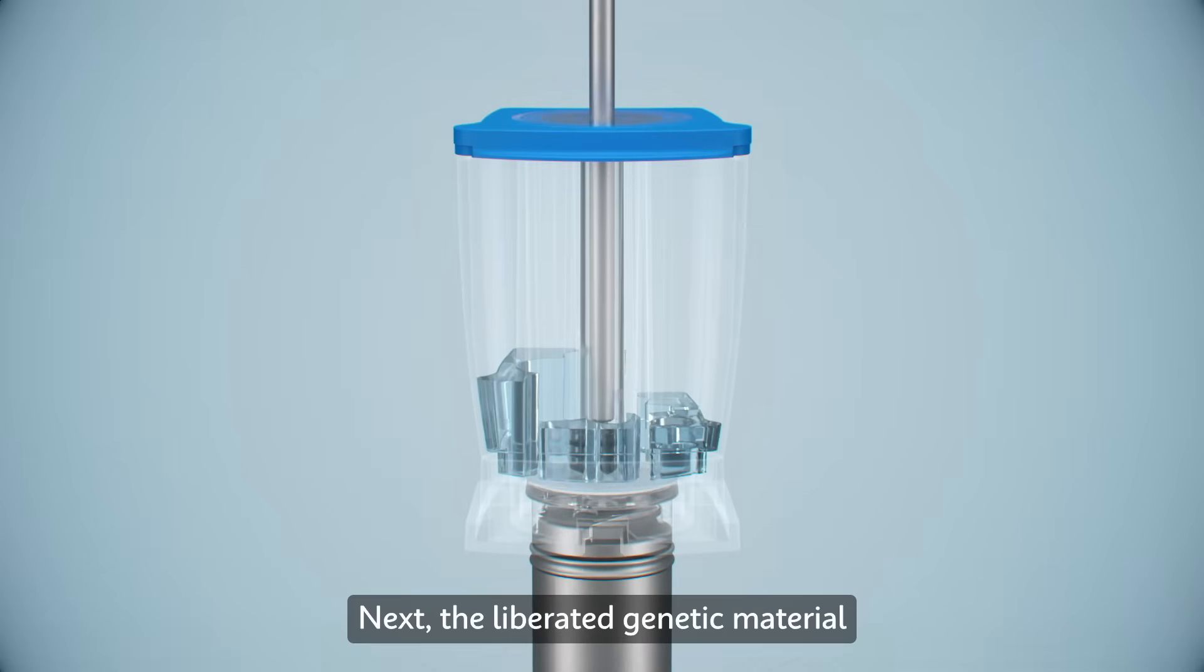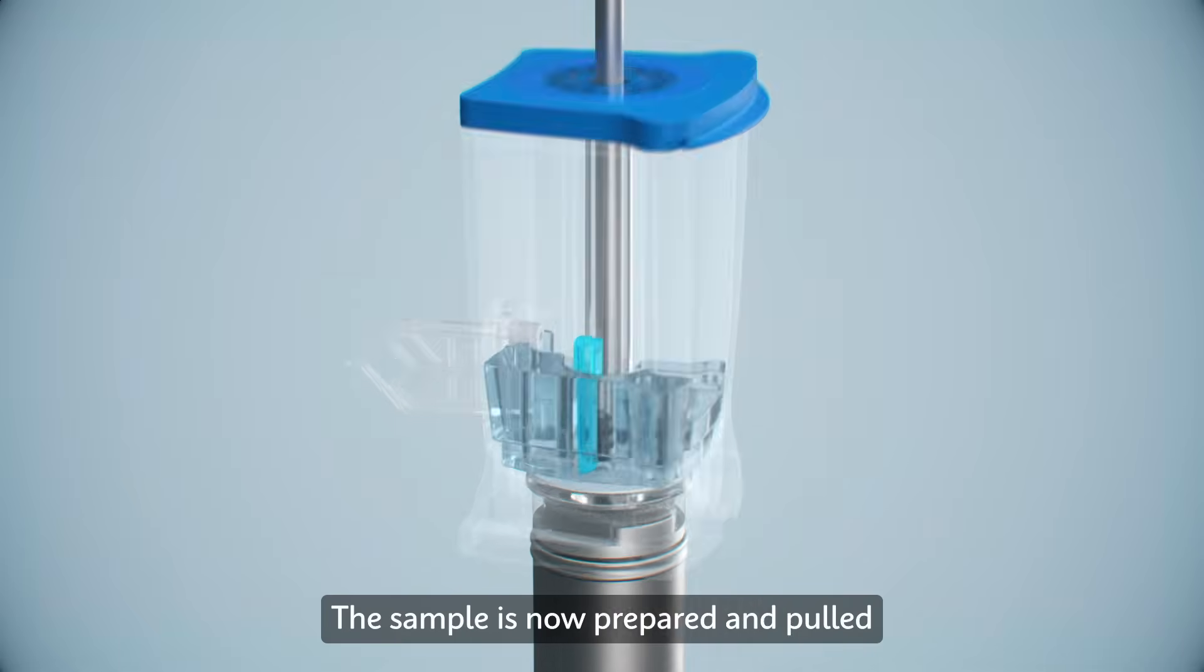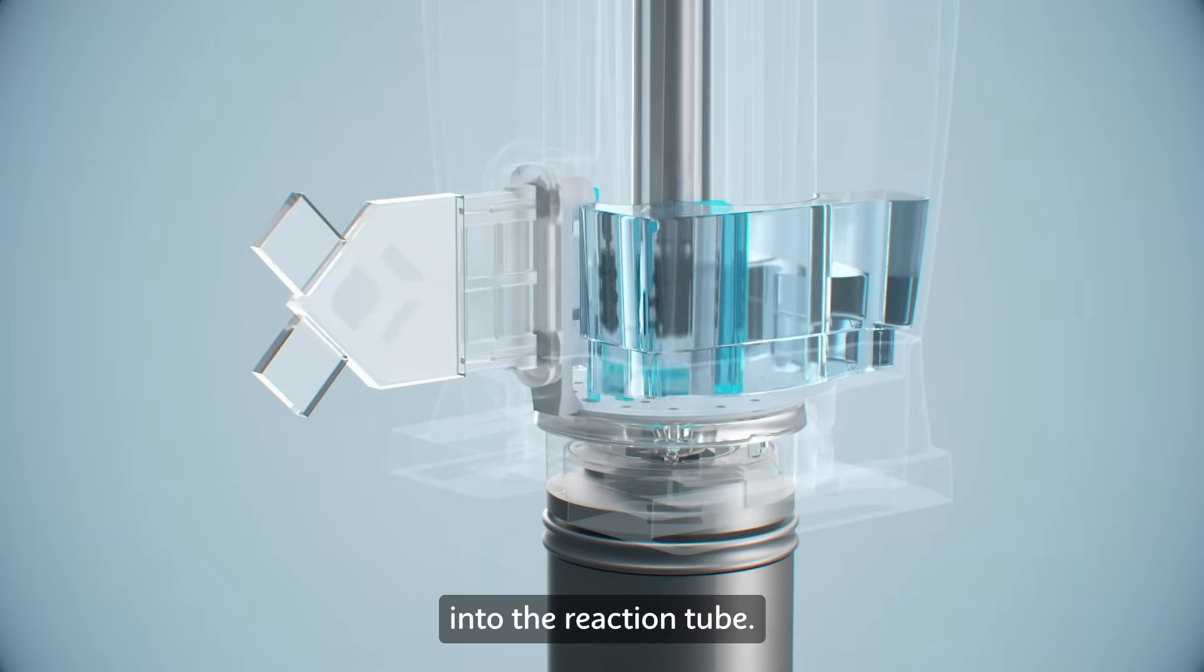Next, the liberated genetic material is pushed into the chamber containing reaction beads. To mix the solution, the plunger cycles the fluid to dissolve the beads. The sample is now prepared and pulled into the reaction tube.